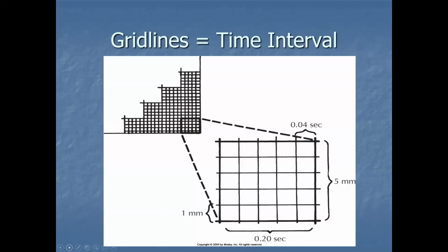So the grid lines, just a quick review. If you recall, I actually do review this stuff briefly when I go for my ACLS recertification. I recertified last summer, so I'm due to recertify in about a year, almost exactly. And I just take a quick look to see, again, the big boxes are one-fifth of a second, or 0.20 seconds, and the small boxes are one-fifth of that, or 0.04 seconds.